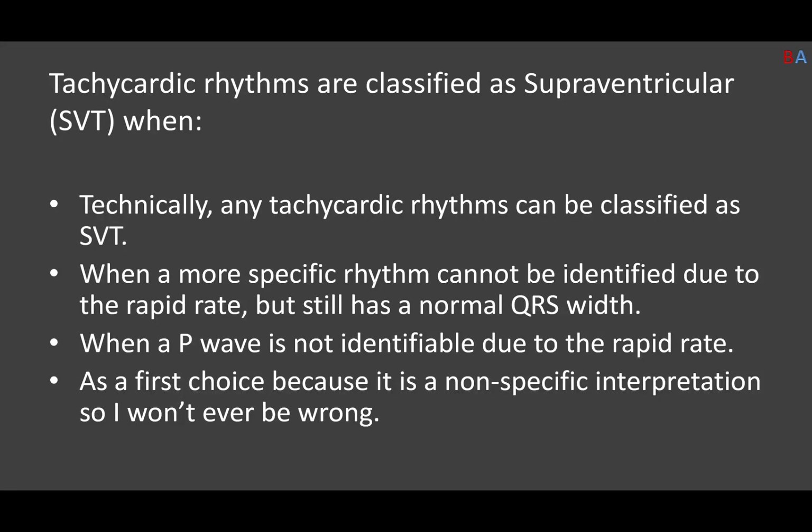Tachycardic rhythms are classified as supraventricular tachycardia, SVT, when which of the following? Technically, any tachycardic rhythm can be classified as SVT. That's absolutely not true. Take that off the list. When a more specific rhythm cannot be identified due to the rapid rate, but still has a normal QRS width. That's actually very appropriate.